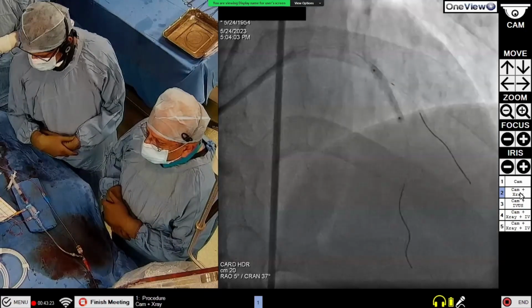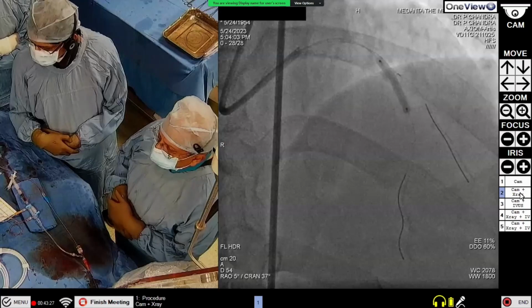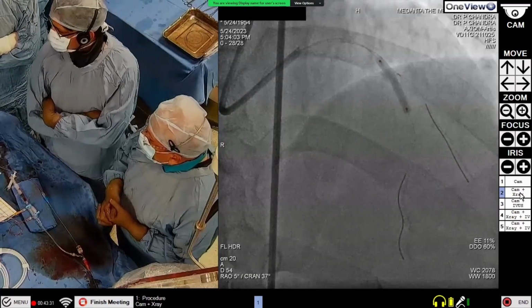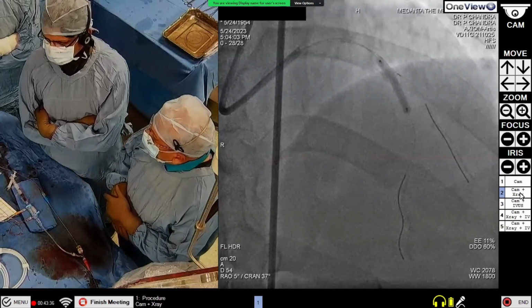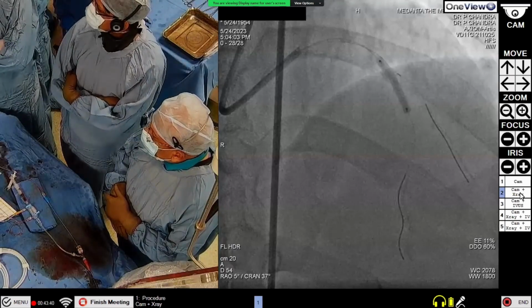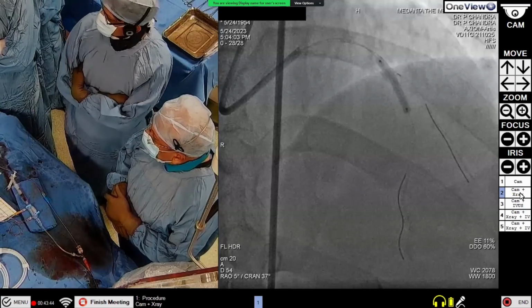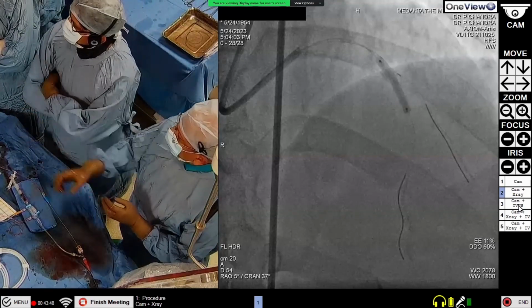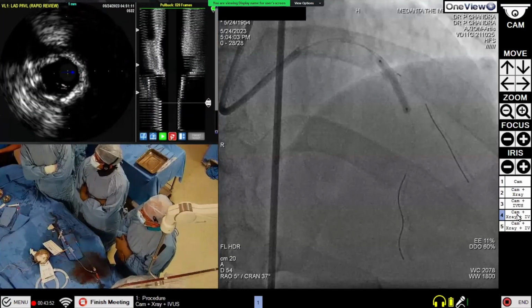Okay. So there is no residual, despite that heavy calcium and everything. And you saw on the IVUS that the ring was so nicely broken and the whole thing got expanded. Show the IVUS, please. Go up a little bit. That's right. So for cases like this with calcium, which is not fully superficial, this is good. Well, how much is the MSA?